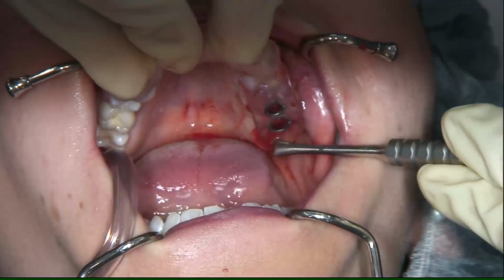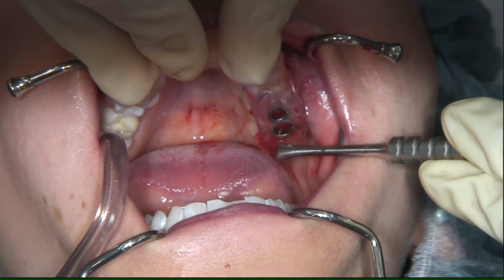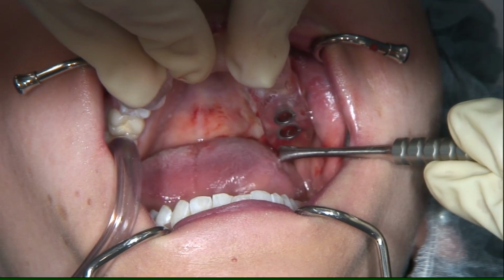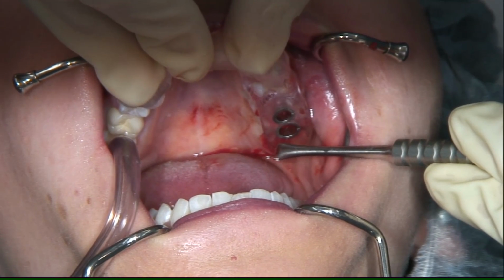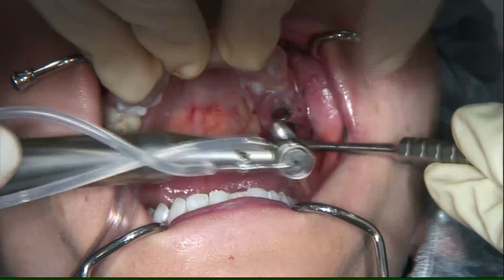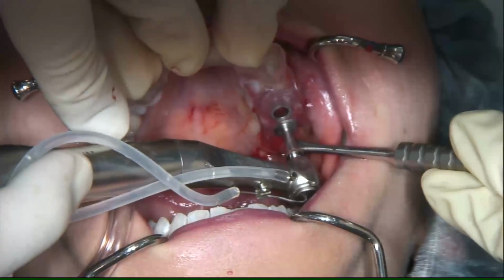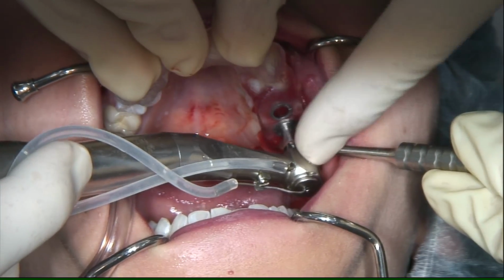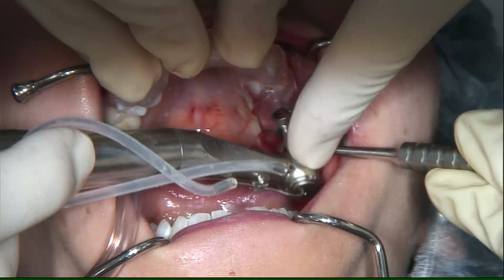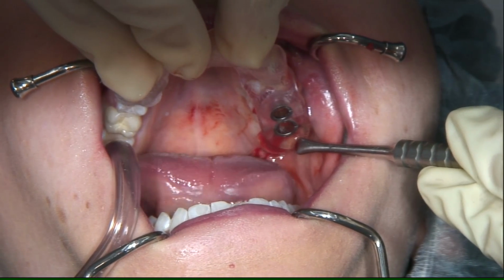We can use this laser for many indications, either for cutting or for hemostasis or for biostimulation and reduction of bacteria. So the next diameter, after the pilot drill of 2 millimeters, is now the next twist drill with a diameter of 3 millimeters.